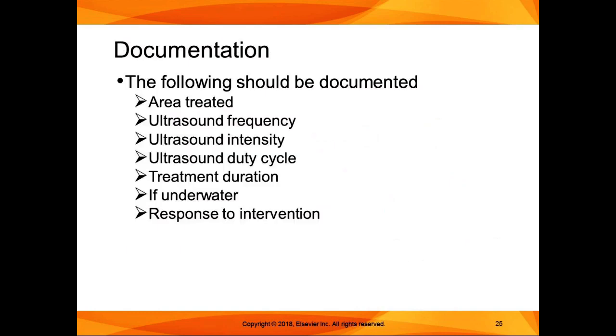You always want to document, of course, the area treated. If you do more than one field, document that. The frequency, intensity, duty cycle, treatment duration. If you don't document that you did it underwater, it will be assumed that you didn't. But if you do it underwater, document that. And of course, with everything we do, we want to document the patient's response to the intervention. The thing we don't want to say is patient tolerated the treatment well. You could say patient tolerated ultrasound with no complaints of increased pain. That's okay. That's more specific, not vague like tolerated treatment well.